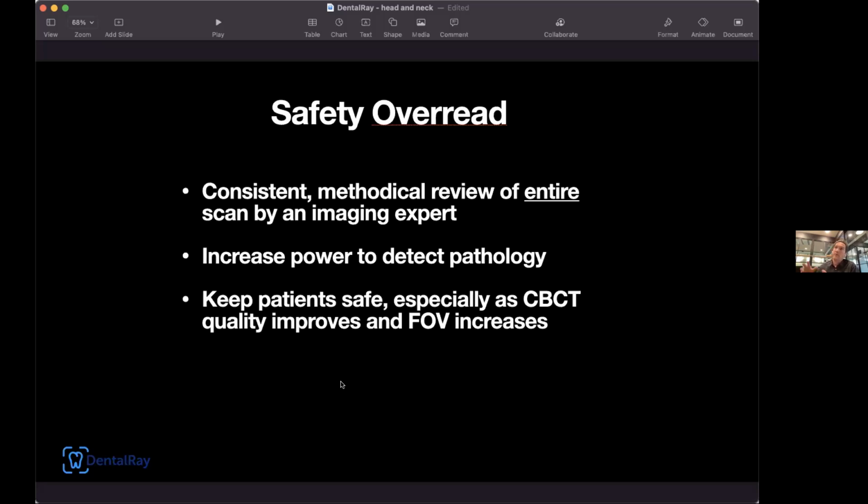Or if it was a patient who had right lower quadrant pain and they ordered a CT scan of the abdomen and pelvis because they were worried about appendicitis, they might be looking at the area of the abdomen where the appendix is to see if it was inflamed, but you have lots of other organs in the abdomen and pelvis that also need to be evaluated because they're within the field of view, and they can potentially cause problems for the patient down the road.